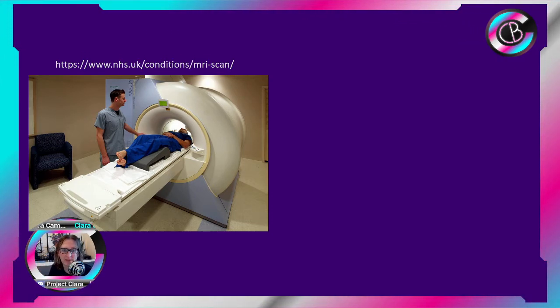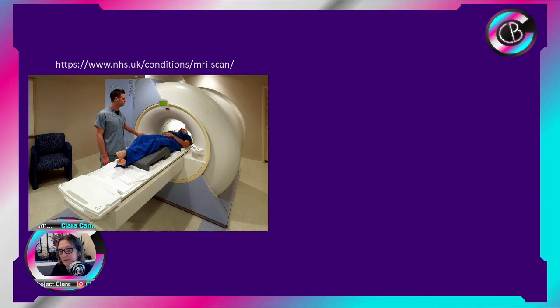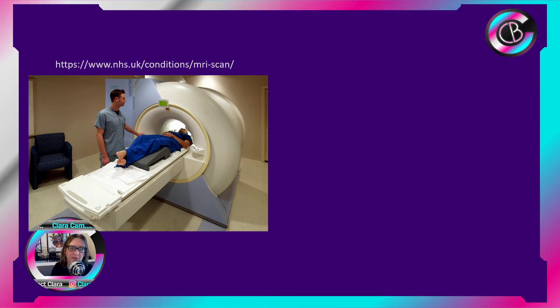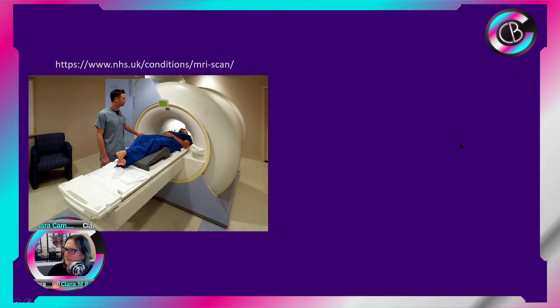You lie on a bed, it moves you inside the ring, and it makes a lot of noise. It's pretty freaky, and if you're like me, I've been in a lot of them and I get a little bit claustrophobic in there, but there's nothing that can be done about that. But I'm going to explain how we use these to get images of the inside of our body.